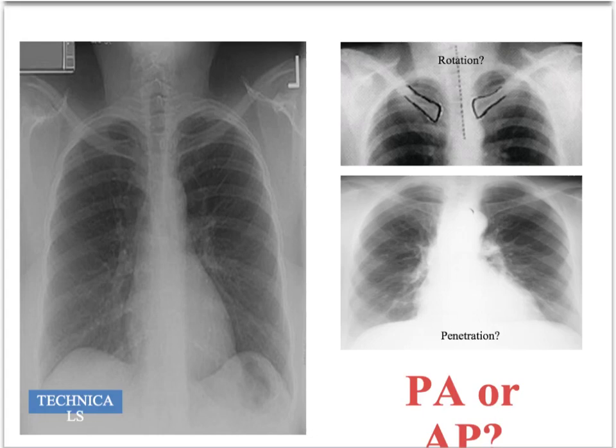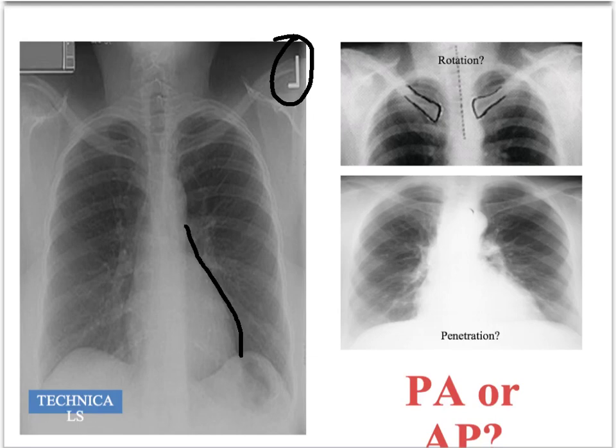Let's start with the technicals. There are a number of issues to concern ourselves with. First and foremost, is the chest X-ray the correct way around? The way to establish that is to look at the heart border. The heart will normally be on the left-hand side, as shown in this X-ray. The only exception is dextrocardia.